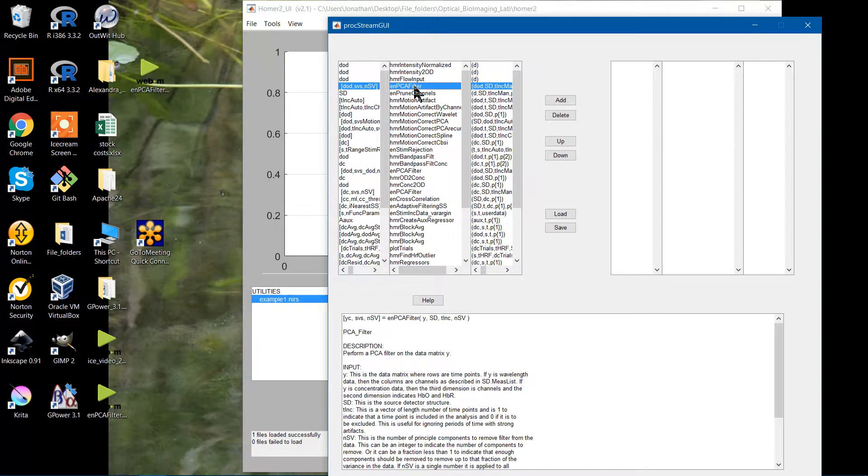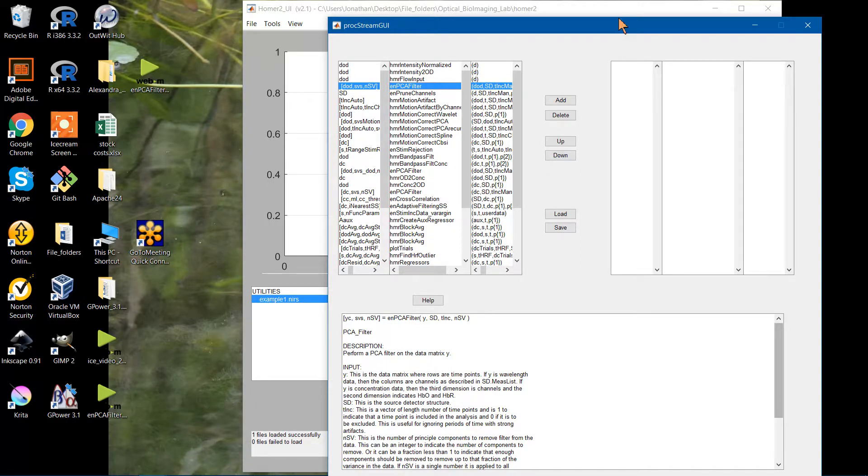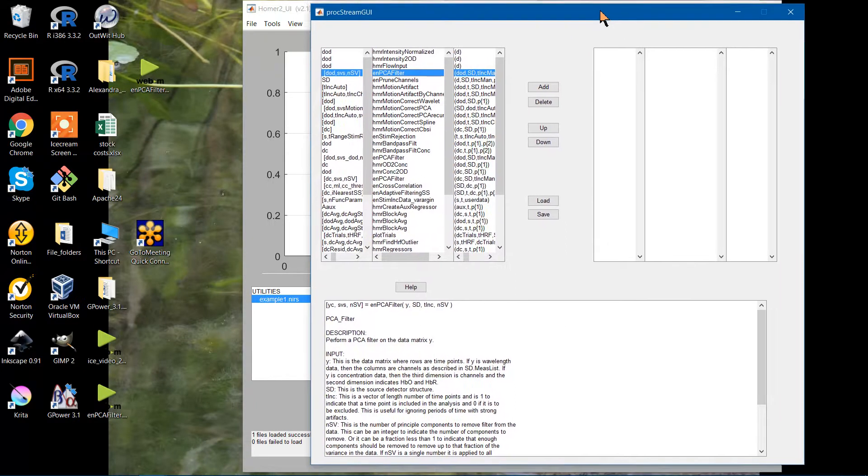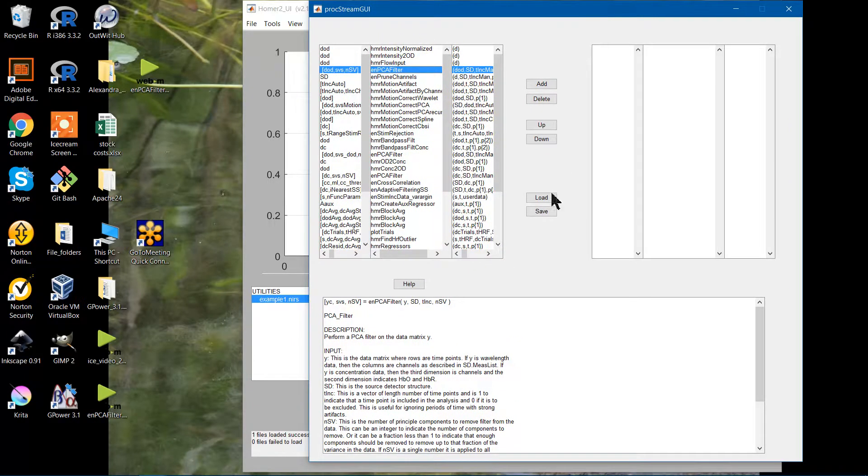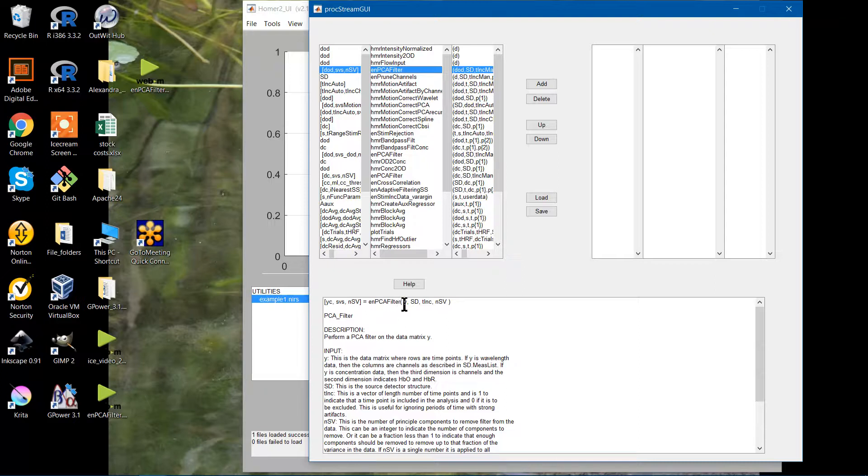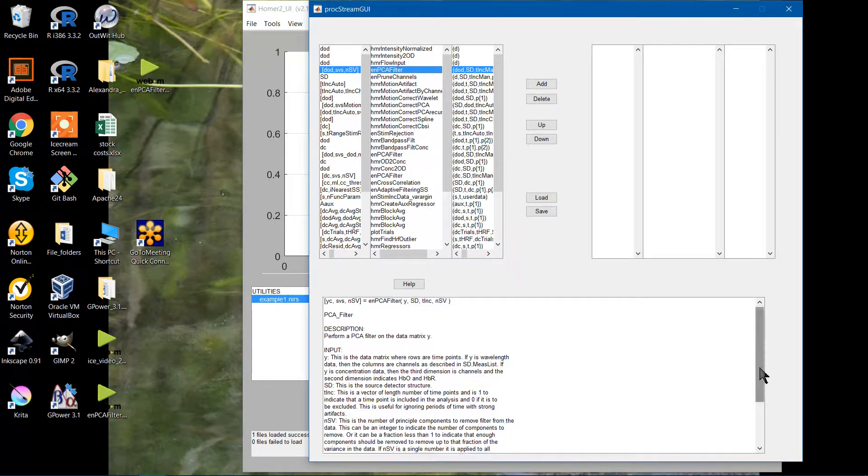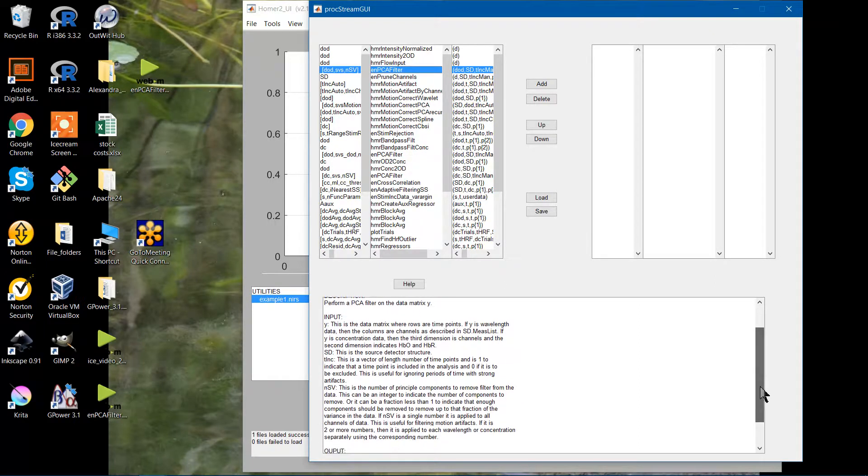This is the PCA filter that's used in the default stream. Down here, you'll actually see a nicely in-depth description. So you have your output right here, the name of the filter, and then your input. Down below, even further, you have a nice description of what each of these inputs are.